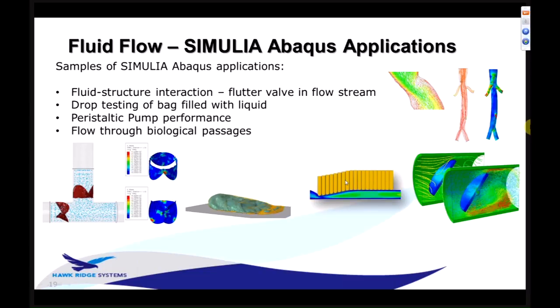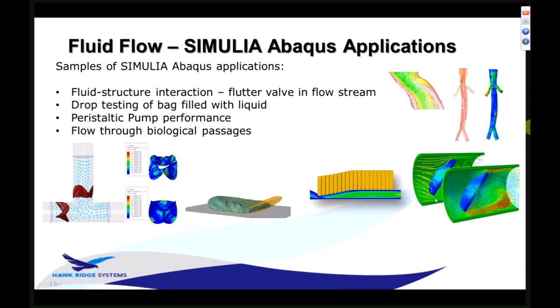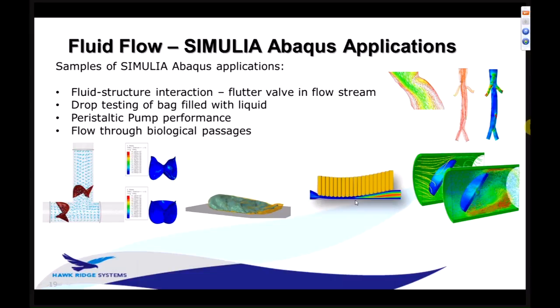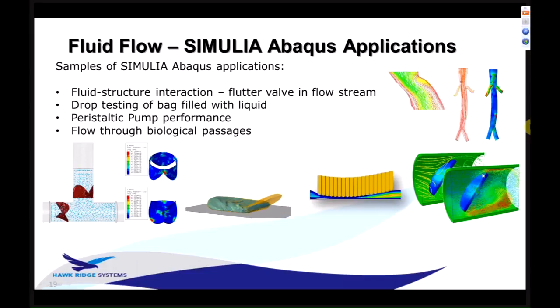We can also get up into the modeling of some pretty complex biological passages. We've got some stuff that's been modeled here. See how they deform as flow goes through them, and that sort of stuff. So Abaqus really offers a next level solution to those situations.